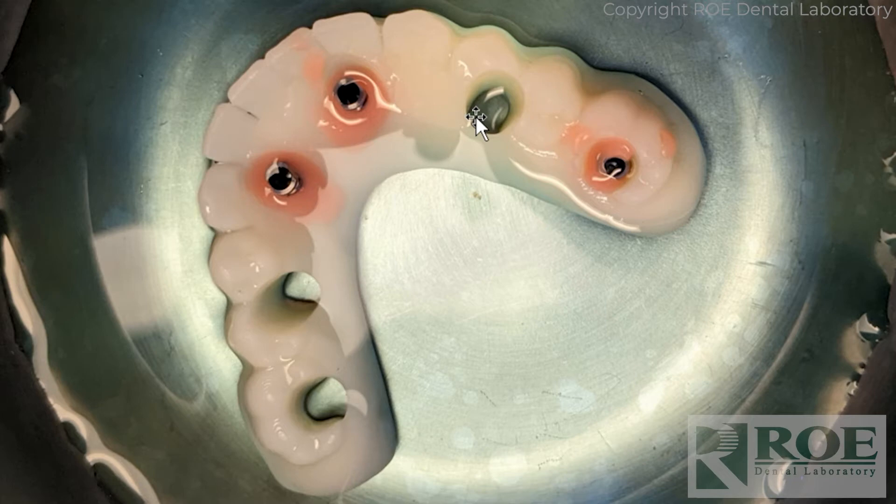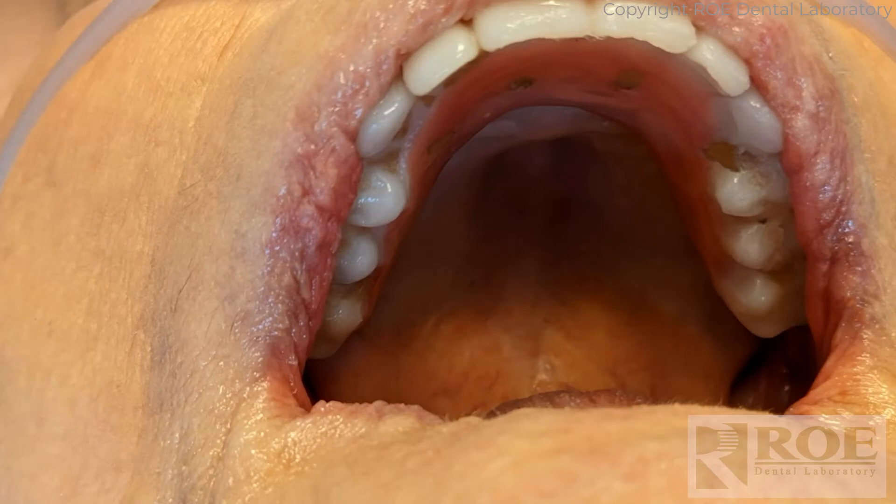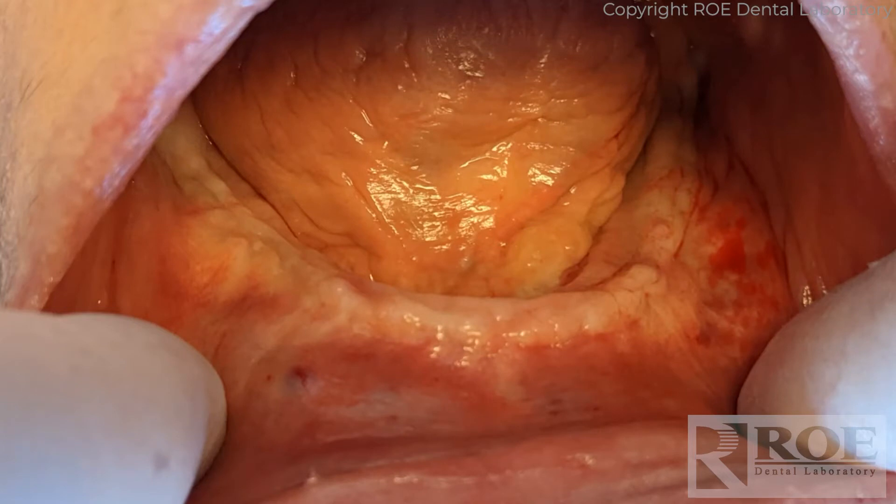Let's go through the process of how that happened in the case last week. When we arrived that morning the doctor was just getting started. In the chrome case was the maxillary C2F model we created, the lower prosthetic that had not been converted, and the lower model ready for the rapid appliance. Here's the upper, which was finished and looking nice with the small holes. Then we addressed the lower.